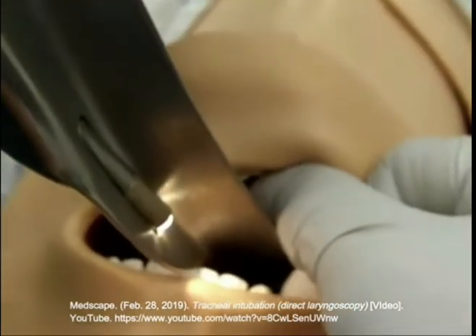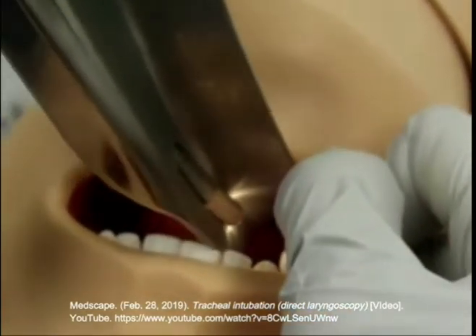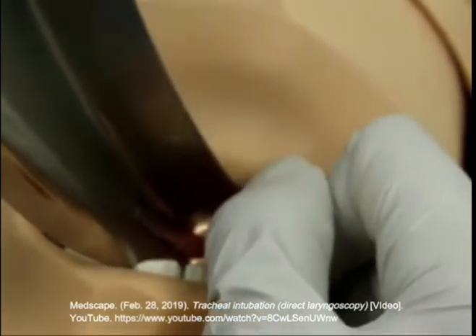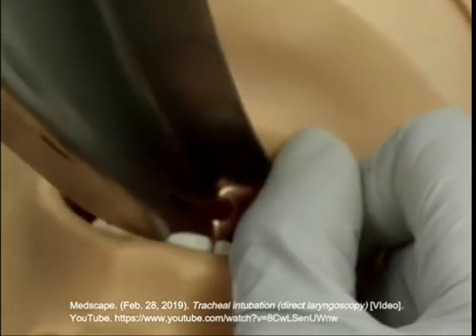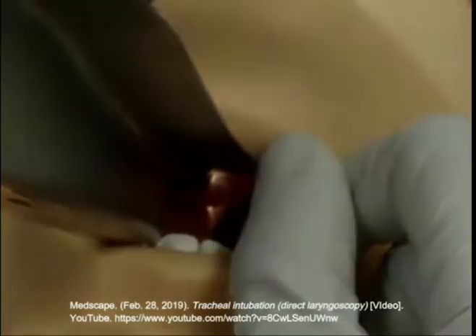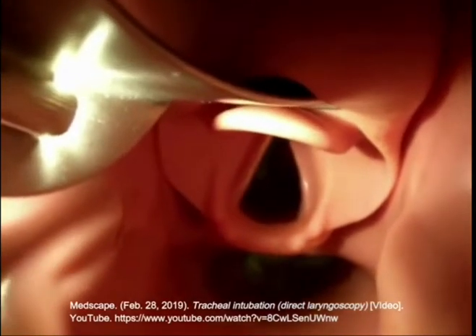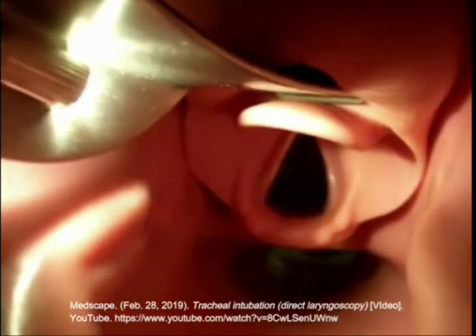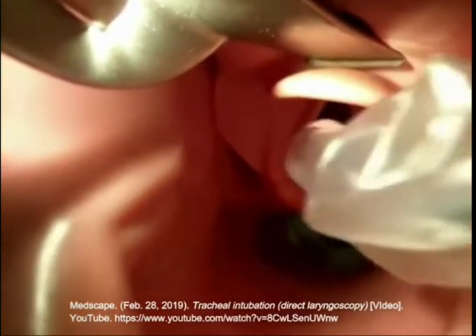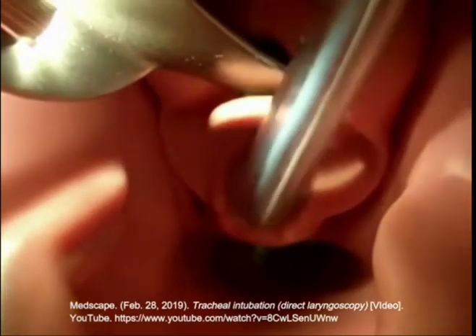Advance the blade along the lingual surface of the right mandibular molar teeth. Sweep the tongue to the left side of the mouth. Use caution when advancing the laryngoscope blade to prevent injury to the teeth and to prevent entrapment of the lip or tongue. With the curved blade, advance while identifying structures until the tip of the blade is in the vallecula. Then lift the handle to expose the glottis. Insert the endotracheal tube into the glottic opening and through the vocal cords. Inflate the cuff and confirm placement.